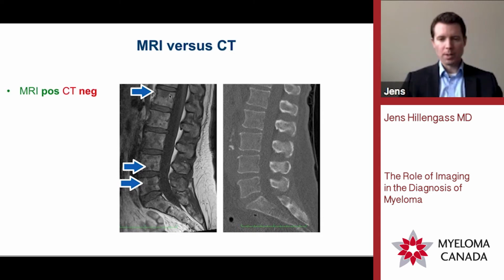And we actually in Heidelberg, we did a study, we put needles in that, CT guided, did a biopsy, and in all but one, it was 65 patients, and in all but one patient, we found plasma cells in there. So those lesions are containing plasma cells. There can be accumulations of plasma cells. That you can see here, same patient, same time point. This is the CT part showing us the bone here, and there's no change. There's no osteolytic lesion. So it is important to know that MRI changes do not always have to go along with an osteolytic lesion. They can, but they don't have to.